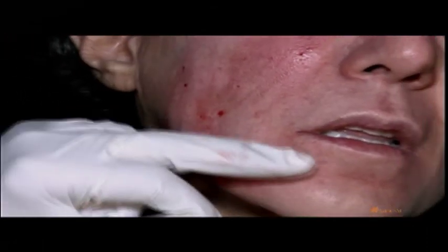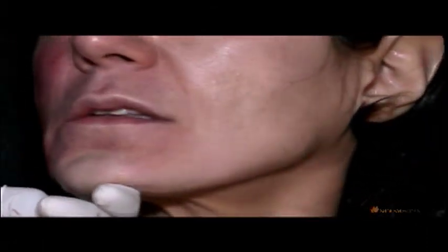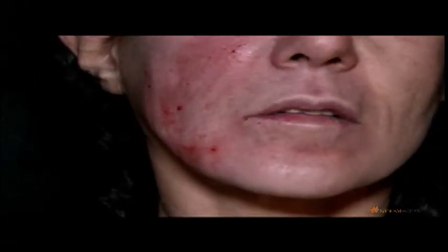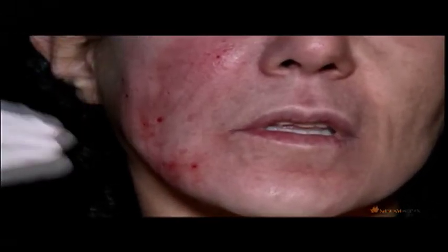Look at that little white line there. And you see the other side, it's not as pronounced. Does that show up on the camera? That's just 0.1 of a cc, and we can already get a little bit more definition for her.